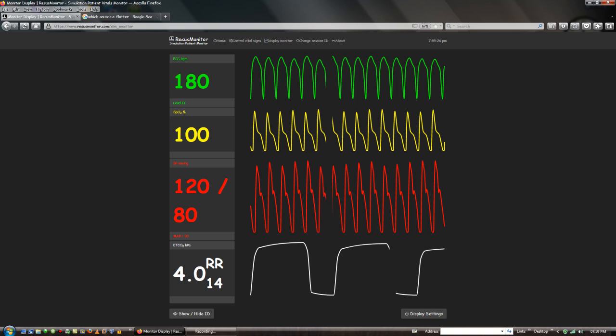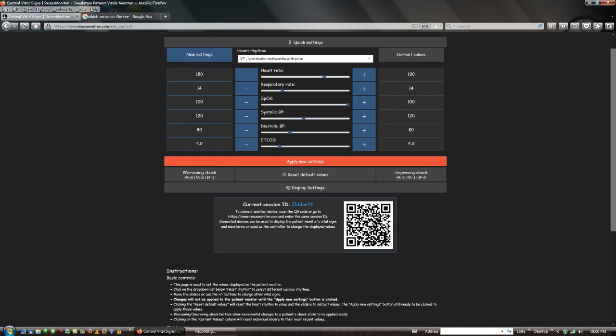That is the most important thing we should do: analyze with the defibrillator, then charge, then shock the EKG rhythm, then give CPR, counting up to 30. When the cardioversion or even the defibrillation is successful, the patient will begin to go back into normal sinus rhythm. I'll display the monitor.